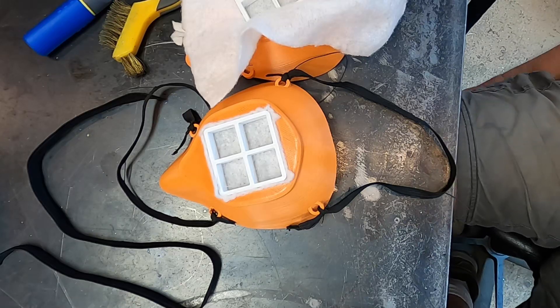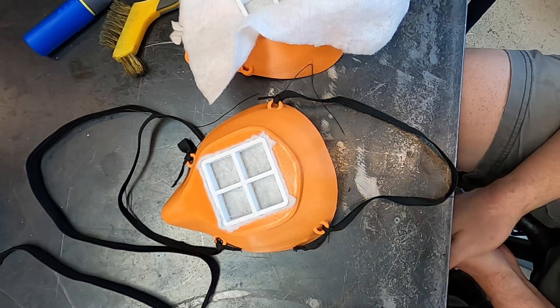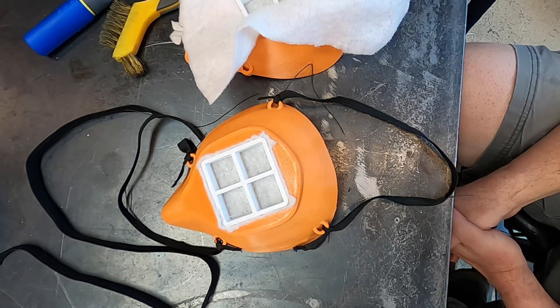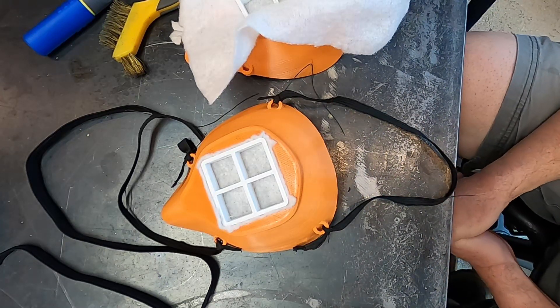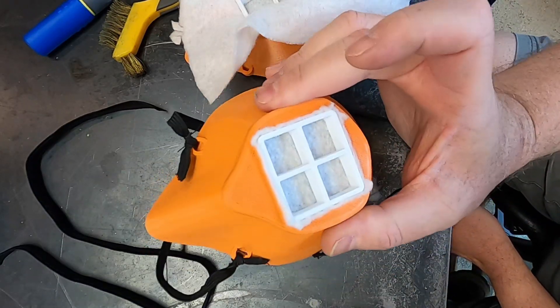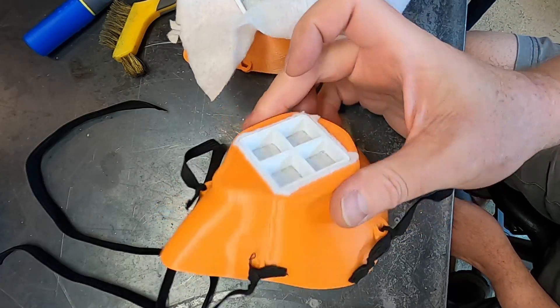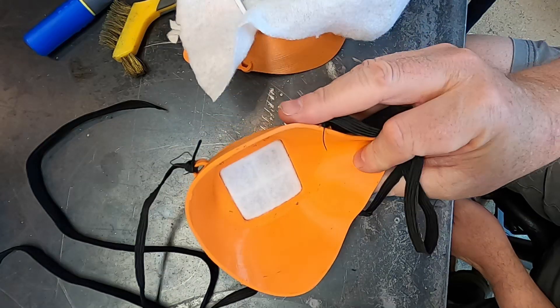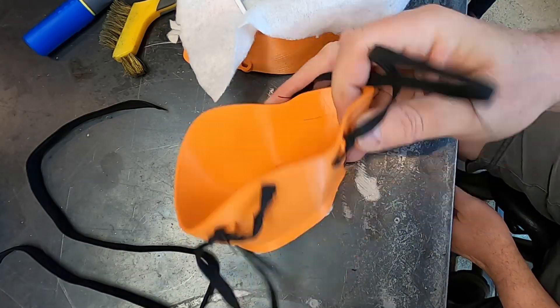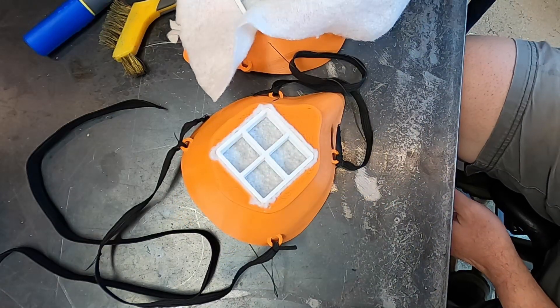It fits my chubby face just fine — no extra sealing necessary — but this is something that would have to be fit on a per-individual basis. This is not a certified mask; this isn't guaranteed to protect you from anything. If nothing else, it'll keep you from touching your face. Anyway, I'll have the links down below for all this information.